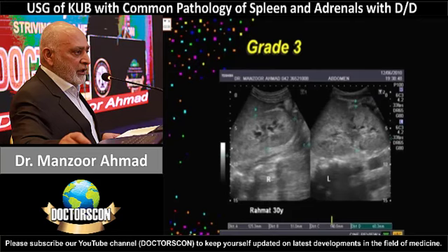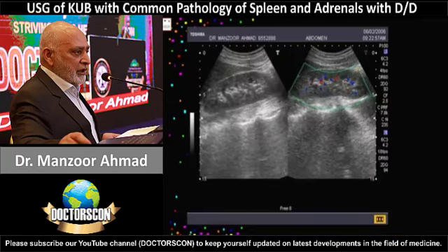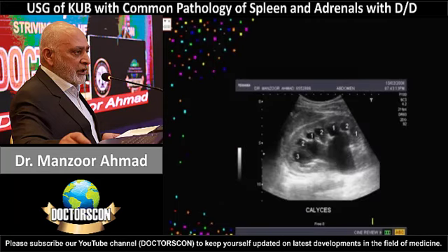The central renal sinus is composed of fibrofatty tissue, collecting system, renal vessels and renal lymphatics, and at Doppler we can see the various vessels within the renal sinus. The renal collecting system is made of minor calyces, major calyces and the renal pelvis. The minor calyces are approximately 7, 3 in the upper and 2 each in the middle and lower segments of the kidney. Then come the infundibulum and the renal pelvis. This is regarding the renal architecture.